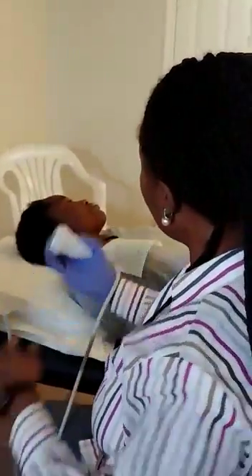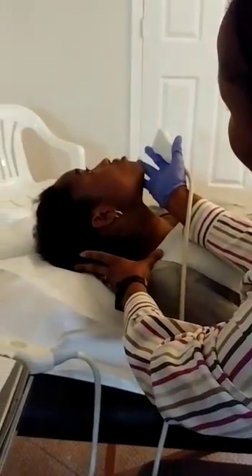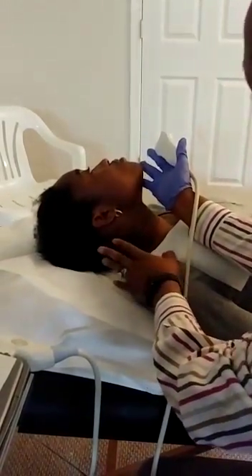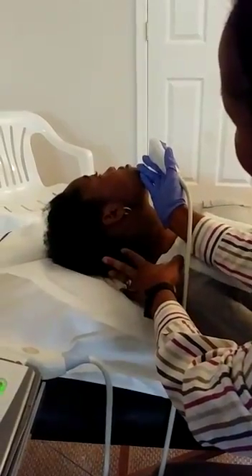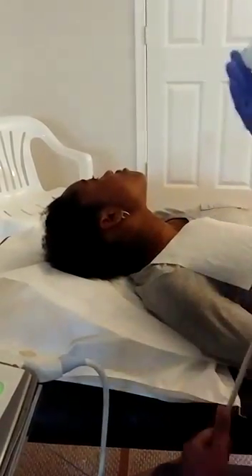Today we'll be discussing ultrasound imaging of the carotid artery. Here with me I have a young lady, and when starting the carotid artery, the first thing you want to do is extend the patient's neck back — not so far back where they're sniffing up, but just extend it back a little bit and have them turn their head slightly to the opposite direction of where you will be scanning.